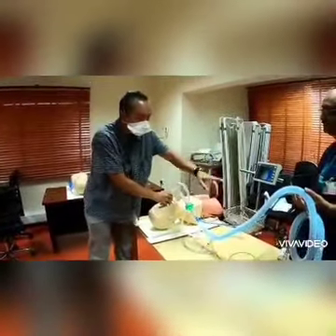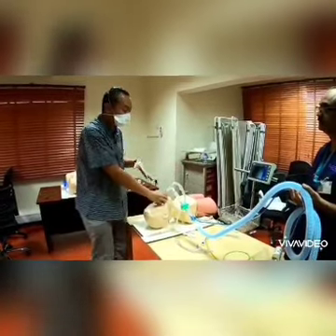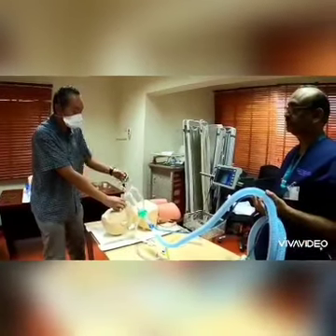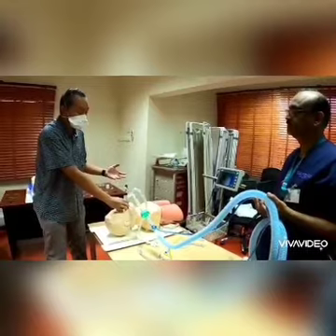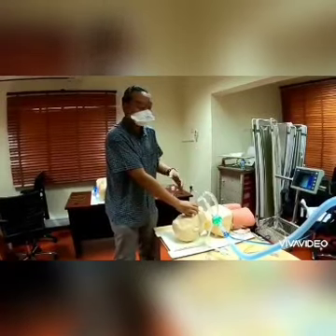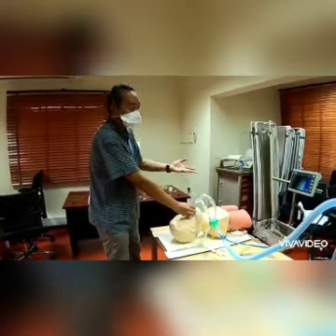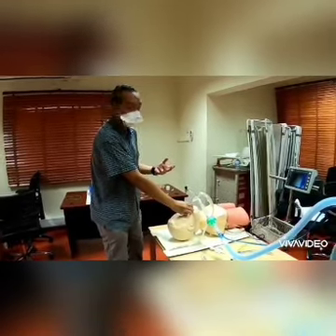So once we attach to the ventilator circuit, in theory, you don't need to listen to the chest anymore. You don't need to use a CO2 detector, and you don't need to do any chest x-ray, because you've done your intubation confirmation through direct vision. By avoiding all these other checking mechanisms, you're reducing your risk of getting a COVID-19 infection.